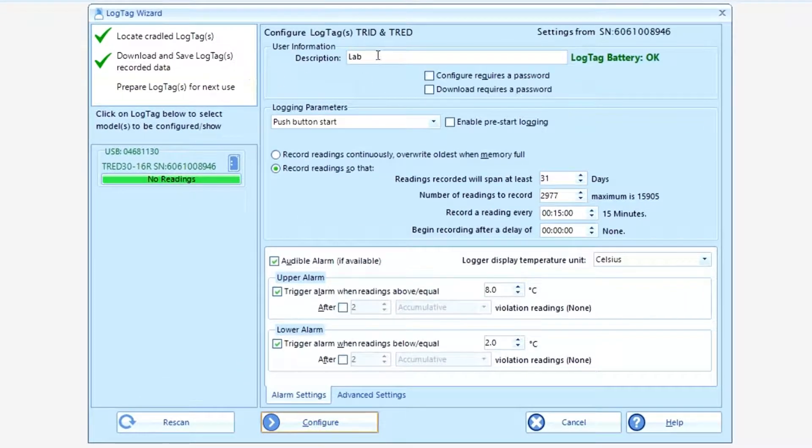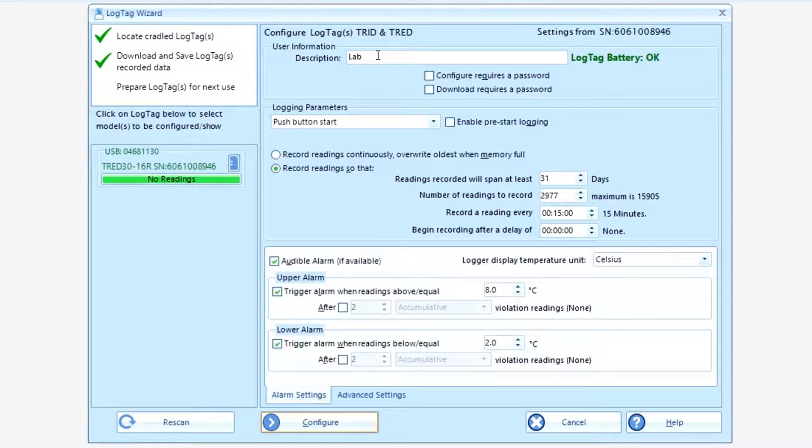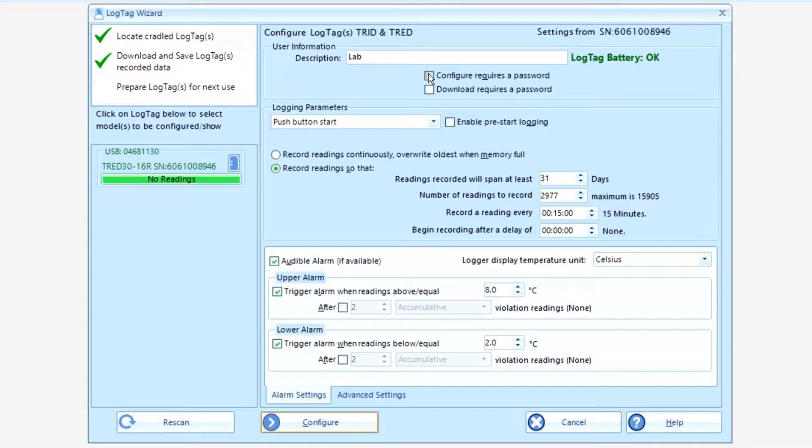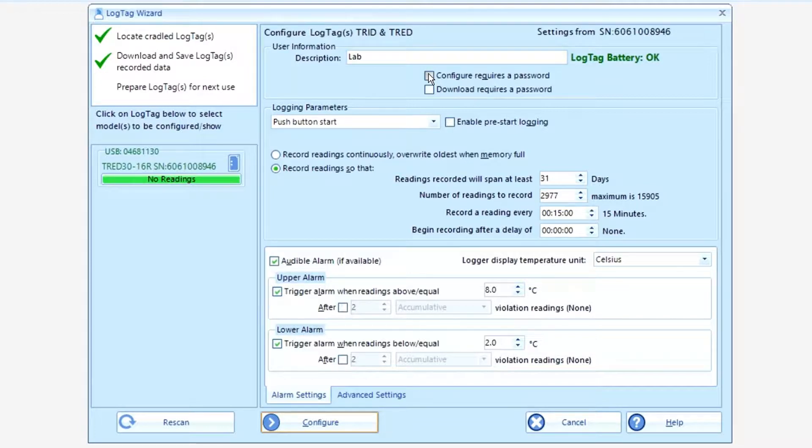In the first field, you can give the unit a description. We've already named it lab. You have the choice of giving passwords to both the configuration and the download. But if the passwords are ever lost, the unit would have to be sent back to factory to be unlocked. Your choice.